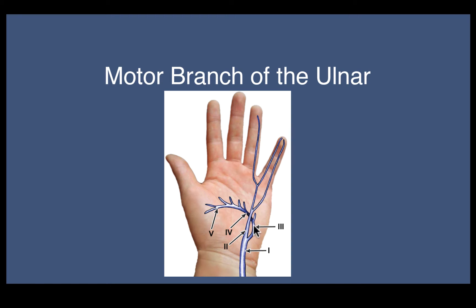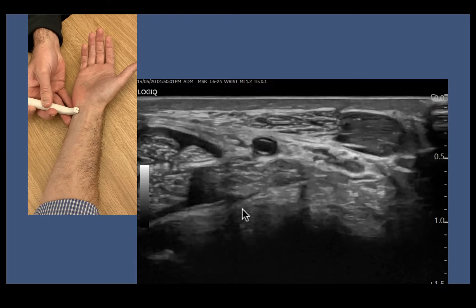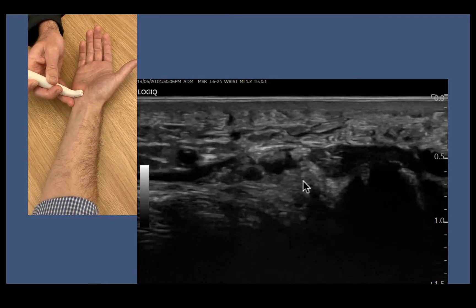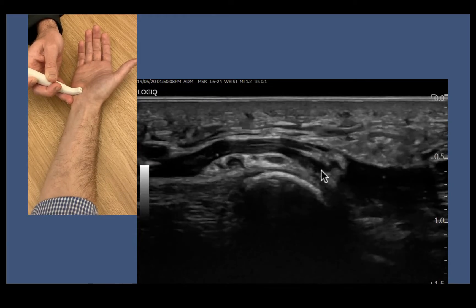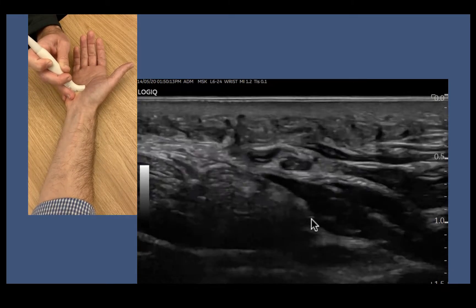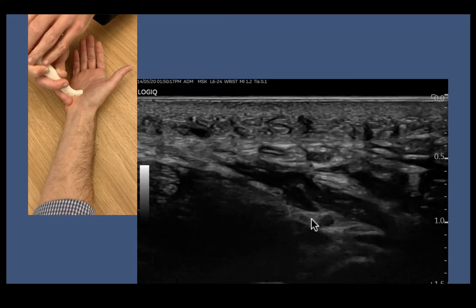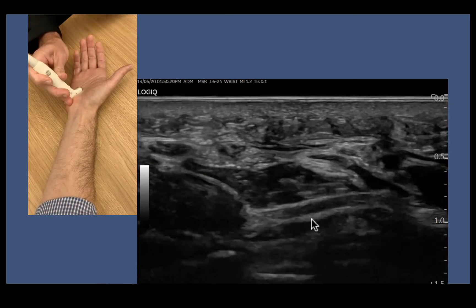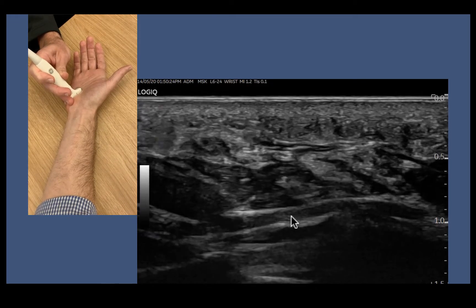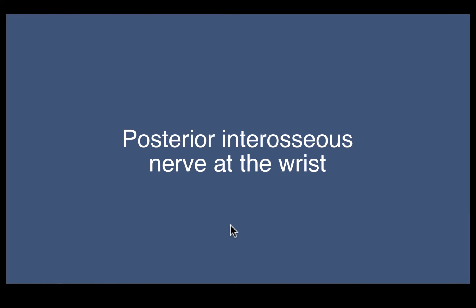The motor branch of the ulnar nerve — the deep branch of the ulnar nerve. Watch our ulnar nerve come down through Guyon's Canal, past the pisohamate hiatus, and in through here. It wraps around the back and runs all the way across to the thenar eminence as it makes its way to innervate the adductor pollicis and the deep head of flexor pollicis brevis. We can turn longitudinal, just turn the gain up a bit, and we can see this nerve nicely all the way through the palm of the hand.